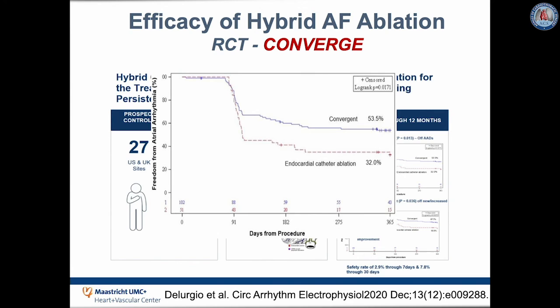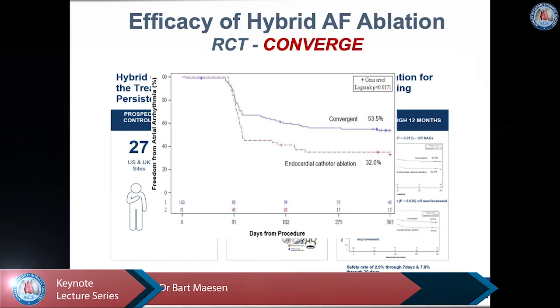But if we compare the results of the convergent procedure with the reported success rates of a thoracoscopic hybrid AF ablation approach, we see that they are lower than the thoracoscopic ones.